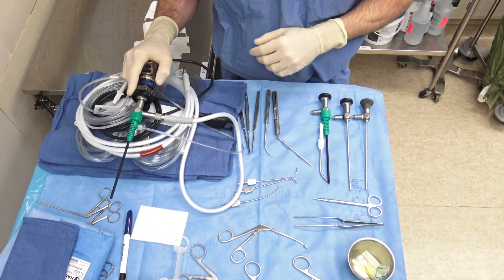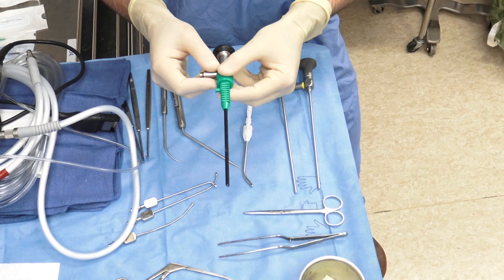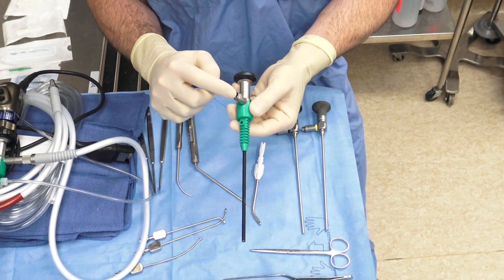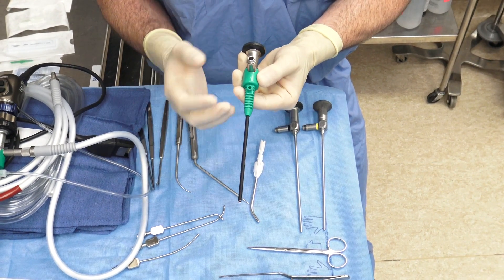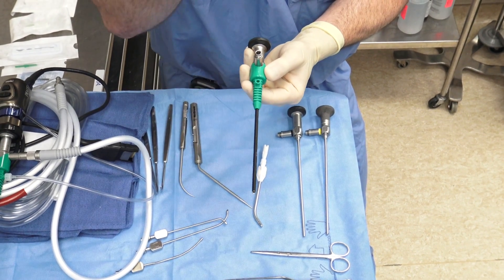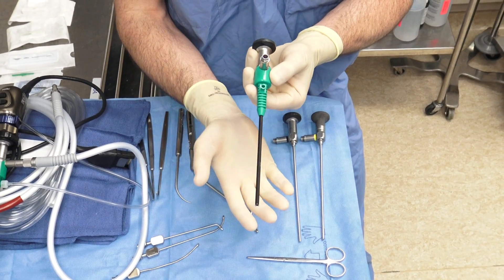As we transition to our other scopes, the next one is the 30-degree scope. In this operating room, we have a reverse-post 30-degree scope, so the post is looking the same direction as the camera. That's very helpful when operating — for instance, doing frontal sinus surgery — as you can still pass your instruments below the scope and the light cord is not getting in the way of your hand down below.